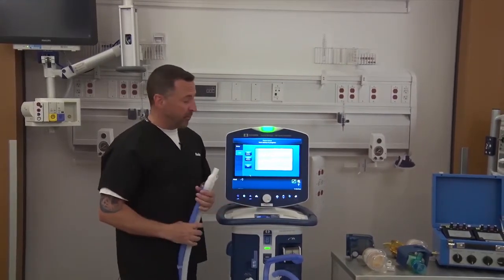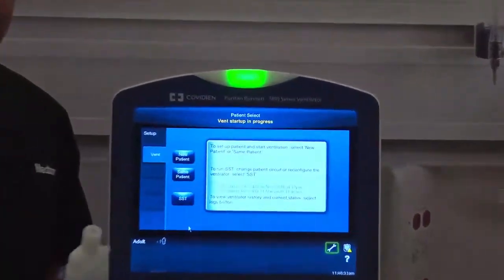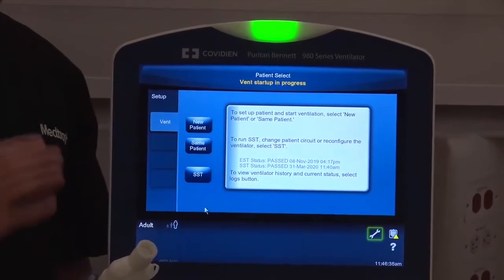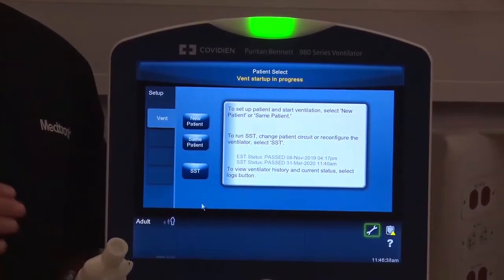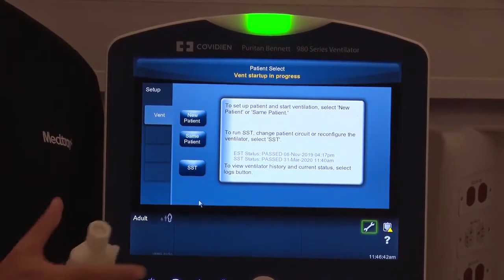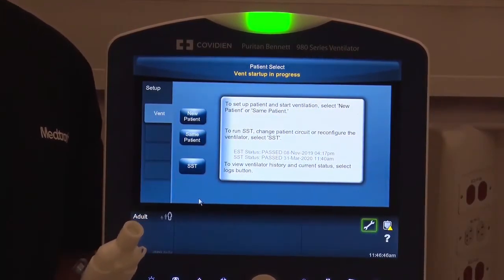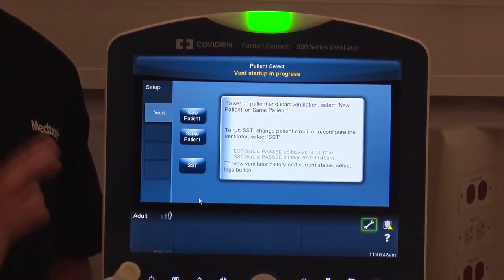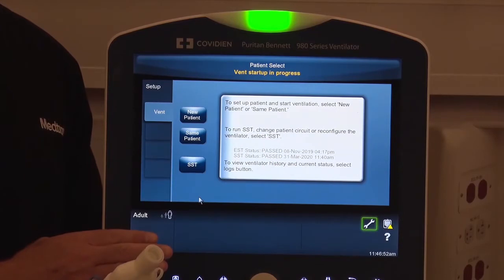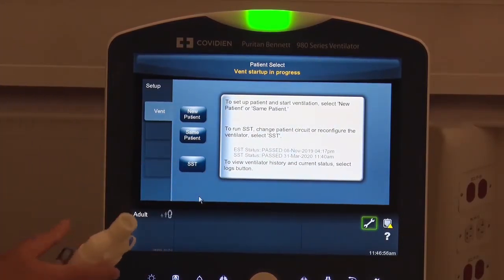It's really very simple. There are on-screen instructions that will walk you through each step, and putting the work in up front, so about 3 or 4 minutes to actually do this SST, prevents you from having to do calibrations of the breathing circuit or any flow sensors thereafter. So it's a convenience in the end for the user. If you'll do the check now, and you have to, your ventilator stays accurate despite some of the things that could be in a breathing circuit.